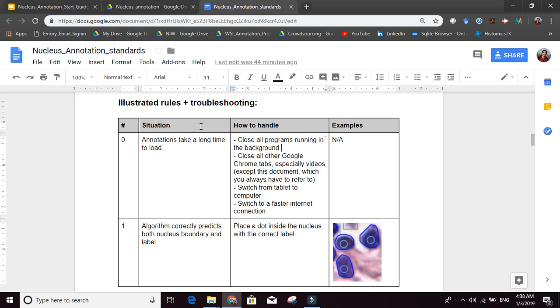All of these background applications are going to make your Histomics TK very slow. They're going to make everything difficult. So close background programs. Make sure you're using Google Chrome and not other browsers, and so on. And if everything else fails, then your internet connection is probably poor, and you just want to move to a faster connection.